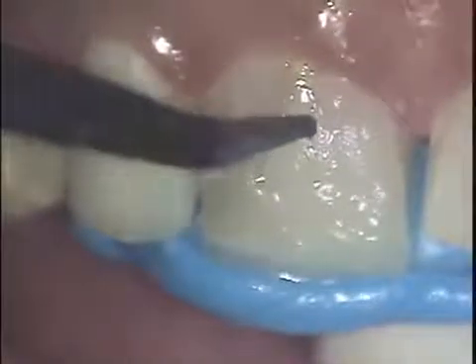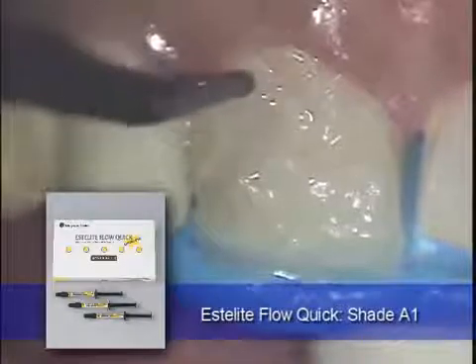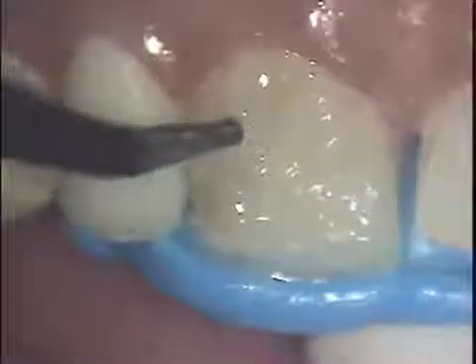Here, Estelite Flow Quick is placed on the gingival 2/3 as well as a small portion of the incisal area for the final facial layer and light cured.